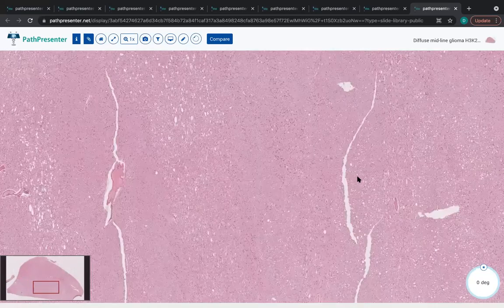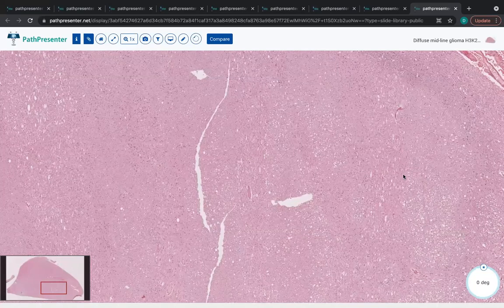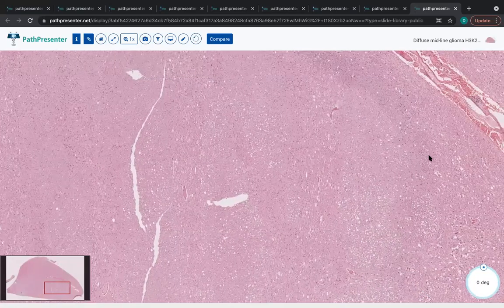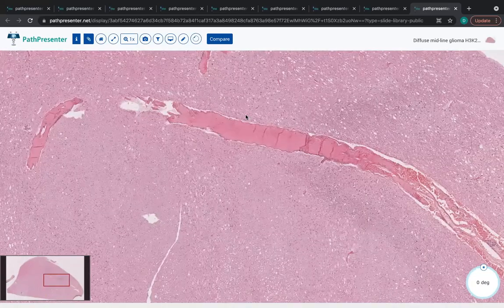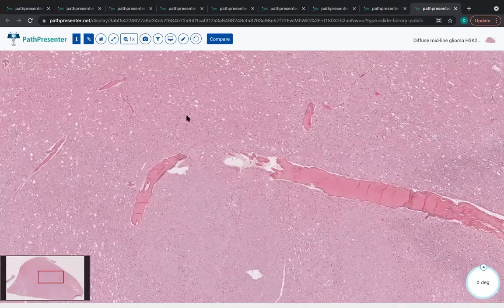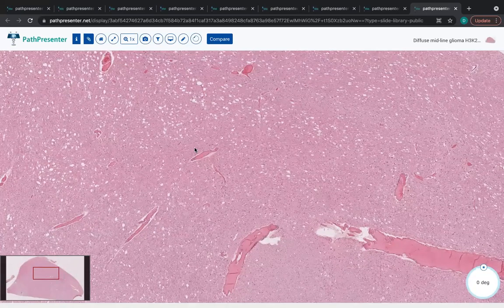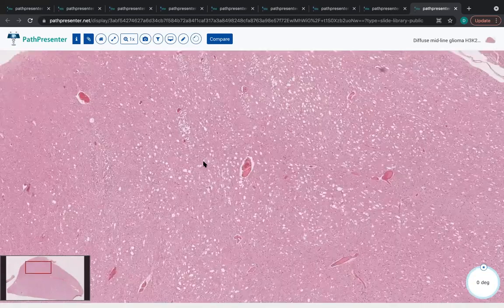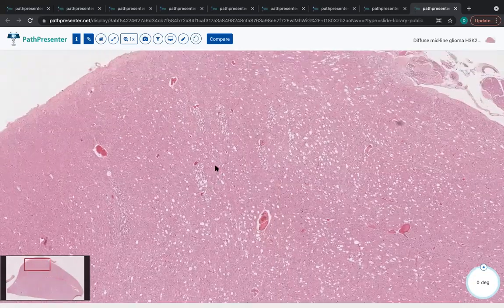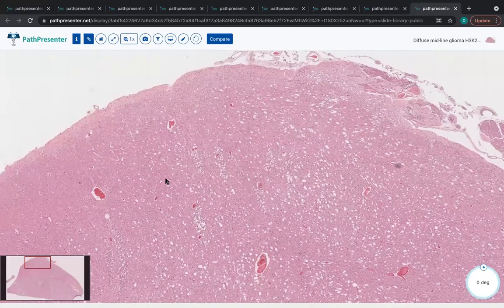If the histology is not a convincing grade 4, then ancillary studies can be performed to flesh out that histone mutation. Anyway, the bottom line is that if one encounters a glial tumor that's present in one of those midline structures in really any age group, have a low threshold for considering this entity. And if one does not have definitive histologic features of a grade 4 tumor, you can just hold off grading it and call it something non-committal like an infiltrating glioma, and then leave it to ancillary testing to figure out whether the histone mutation is present or not.